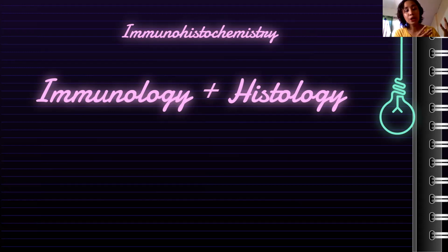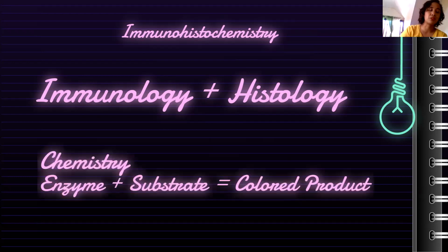But polyclonal antibodies, guys, are cheaper to produce. And what's amazing about polyclonal antibodies is that they attach to different sites of an antigen. So, it's unique. And it could also attach to another antibody, depending on what it is specified for. So, class, an antibody could attach to another antibody, which we'll discuss later.